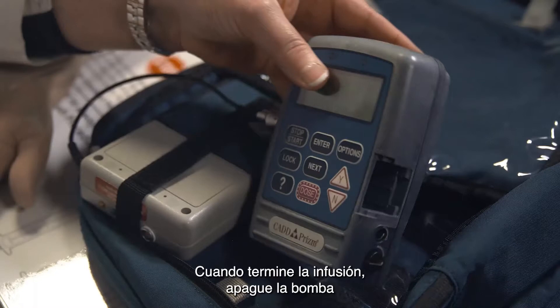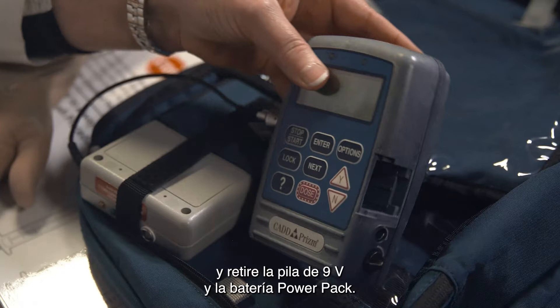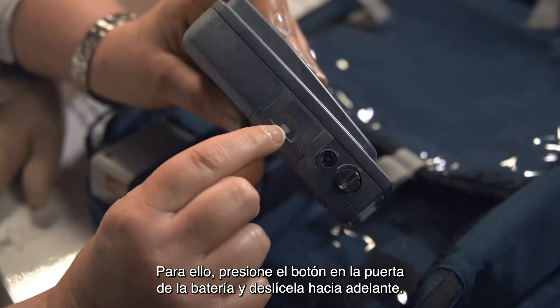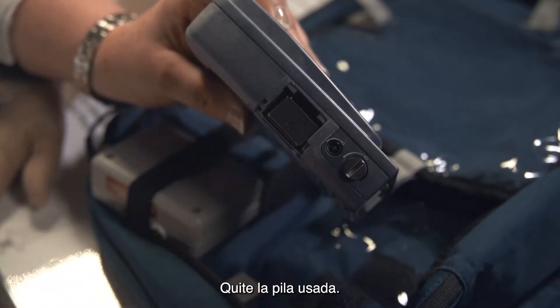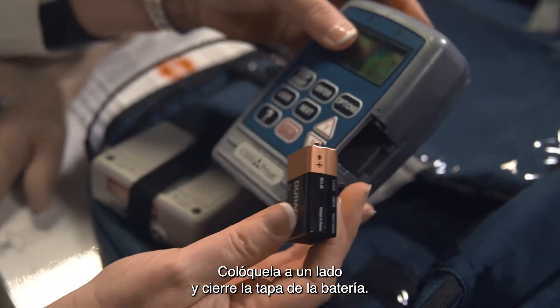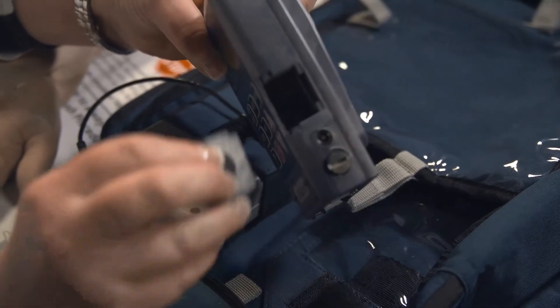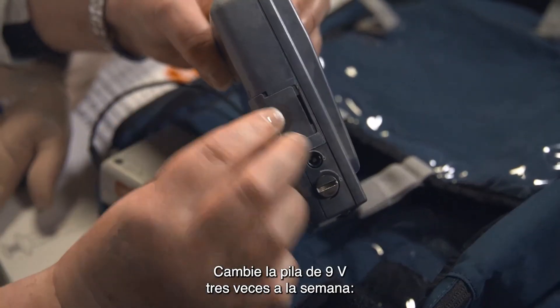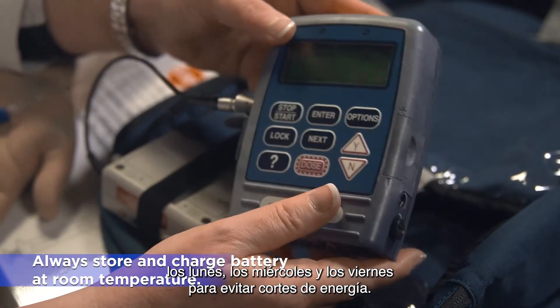At the end of your infusion, you will power down the pump after you have stopped the infusion by removing the 9V battery and the power pack. To do this, press the button on the battery door and slide the battery door forward. Remove the used battery, set it aside, and replace the battery door. Replace your 9V battery three times a week — Monday, Wednesday, and Friday — to prevent power failure.